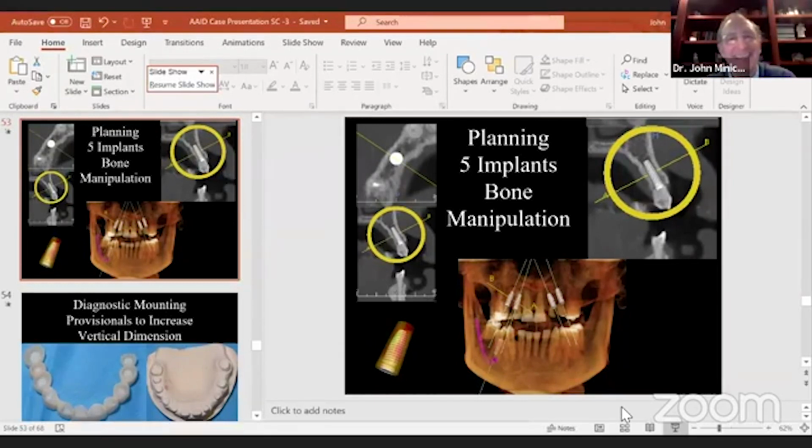How did you index the implant placement? I don't know if you're talking about indexing for prosthetics or indexing implant placement. I mean, for the surgical guide, certainly you could make a prosthetic guide, make a clear suck-down of these temporaries, but I'm basically just using the provisionals here as a guide, because the case was already provisionalized. And we have positioning from the teeth that we're removing because it's an immediate implant placement. So that's how I indexed this patient. This is basically immediate implant placement.